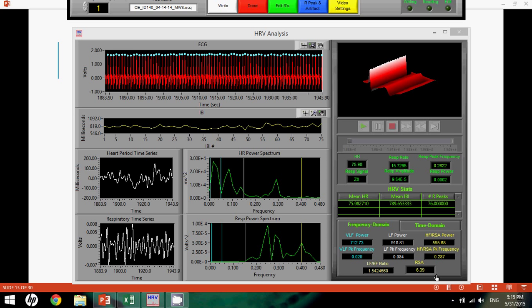And even when you're going through normal files, it's not usually the case that you use these a lot. It's only the case that you use them in case you need to really interpret. Again, we'll go into this in a future video.